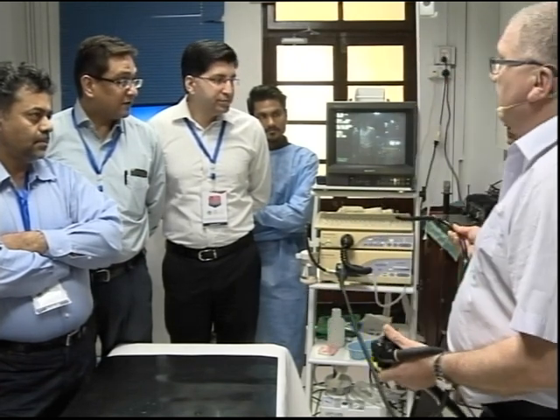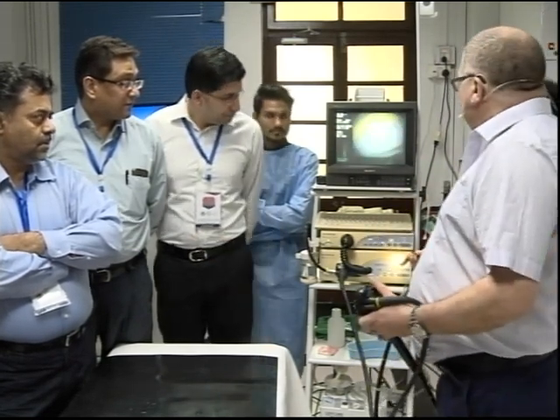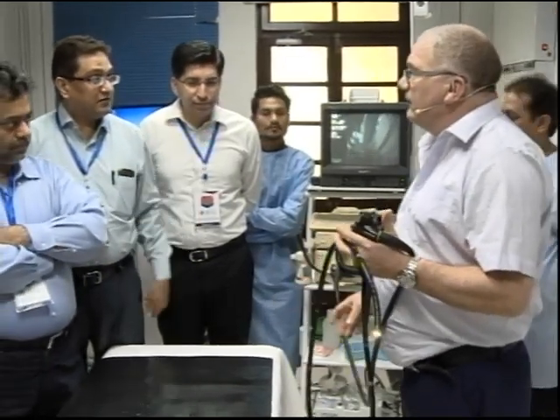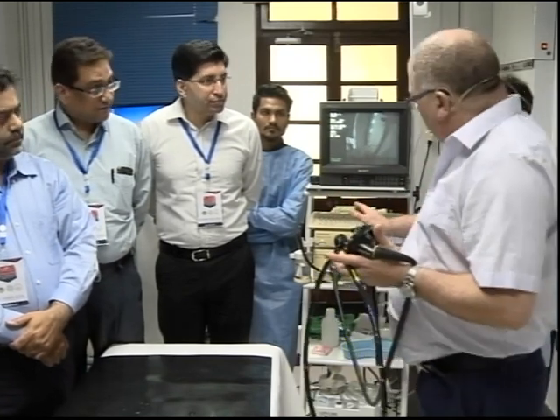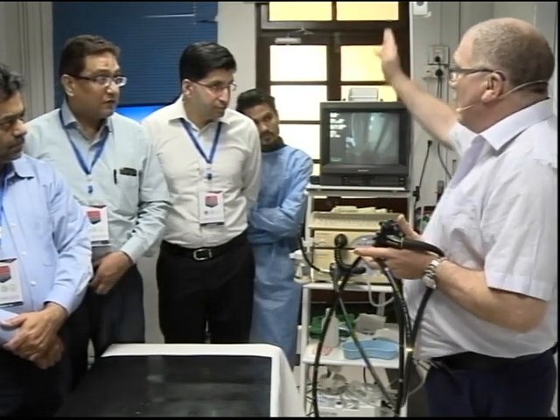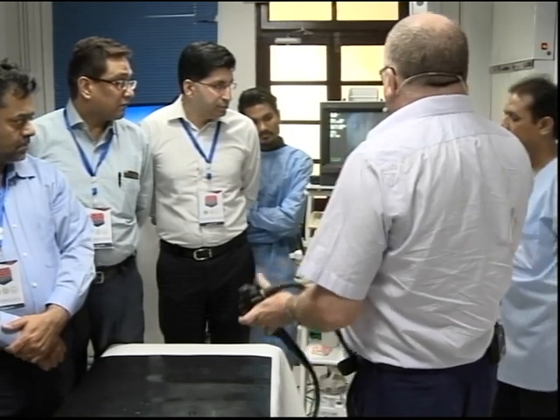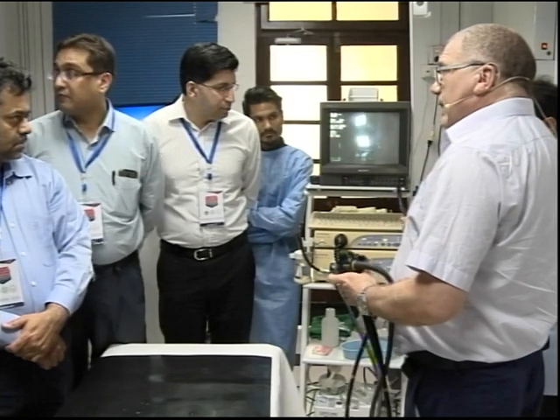So why is it doing this? On the screen, not the tip. Ignore the tip. So watch the screen. If you watch the screen, it's going up. I rotate the scope, it's going up. Why? The movement of the scope is changed, but what I'm saying to you is that the processor will always optimize where the tip is going, and it will always turn it to 12 o'clock. Regardless if I've got the scope looking to the left, it will always go to 12 o'clock. Regardless if I've got the scope looking to the right, the scope will always go to 12 o'clock. Regardless if I've got it pointing there, and naturally it will always go to 12 o'clock.